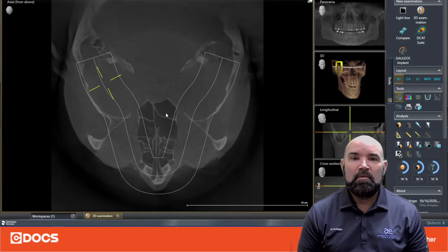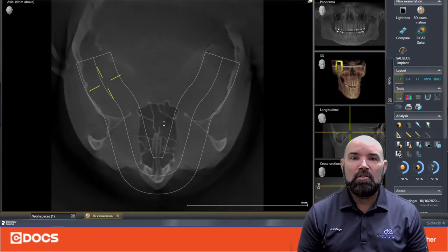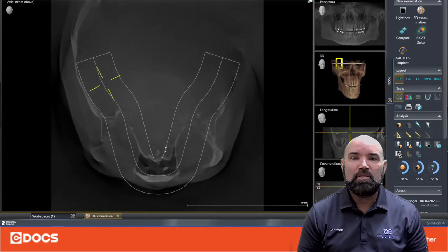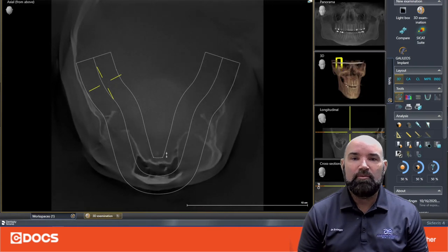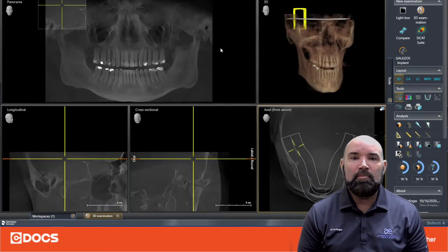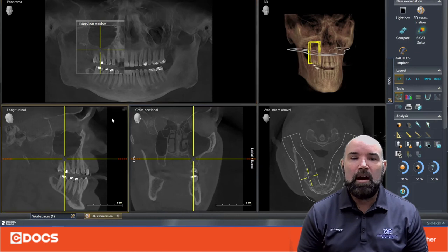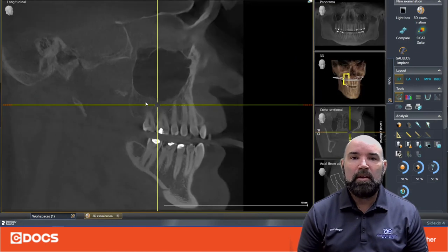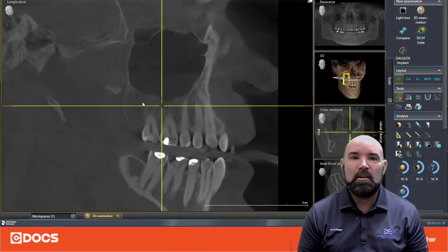Given that this is a large field of view, we can actually have visualization all the way up to the frontal sinuses. So we get a clear picture of what's going on, and it opens up our scope of practice to different modalities, including airway, sinus, and TMJ.